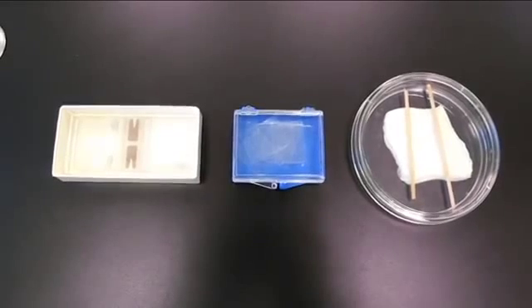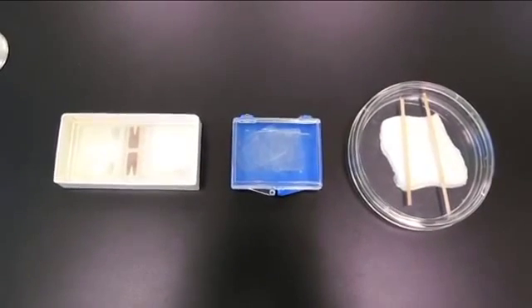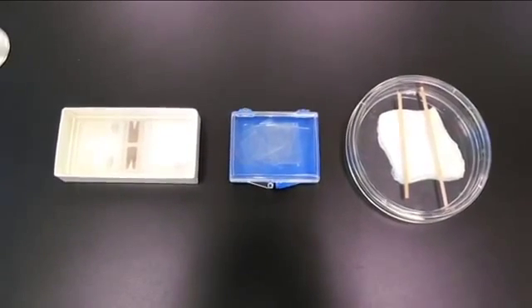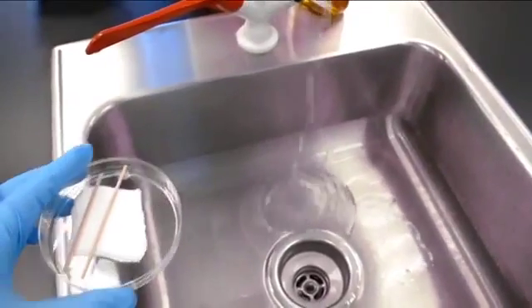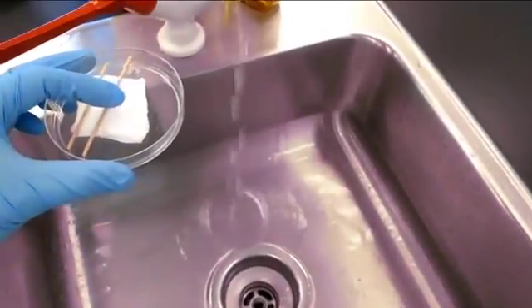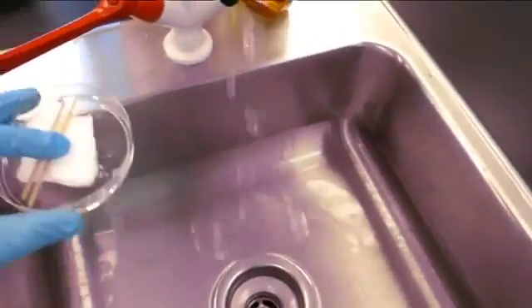While waiting for the solution to mix, obtain the following materials: a hemocytometer, a cover glass, and a humidity chamber. Wet the gauze in the humidity chamber by placing a few drops of water on it.